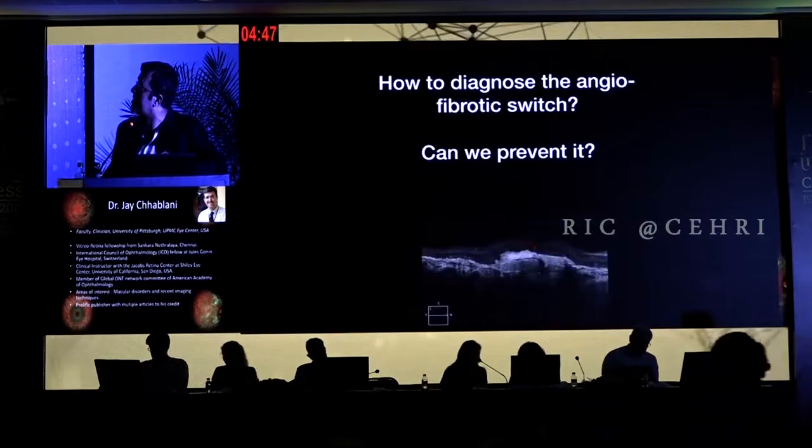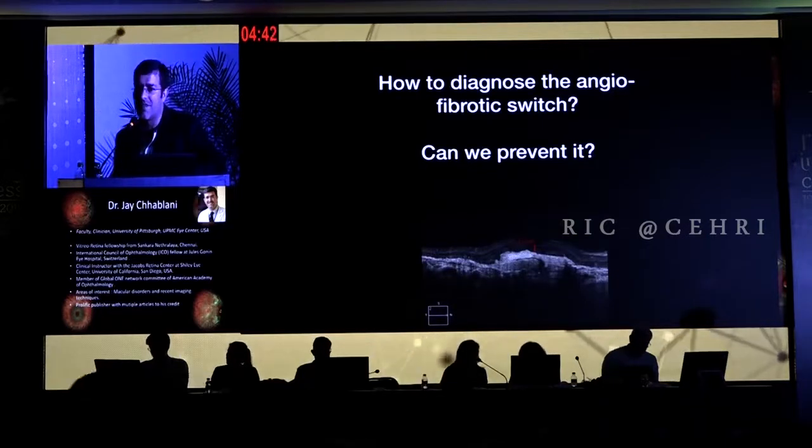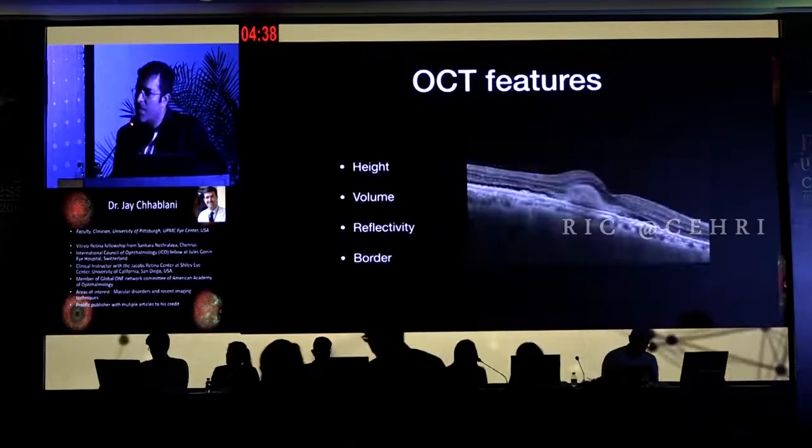and we need to find out the risk factors for this fibrosis. So today's question is, how do we actually diagnose this SHRM? Can we actually prevent this subfoveal scarring which is going to happen? So let's start with the OCT.